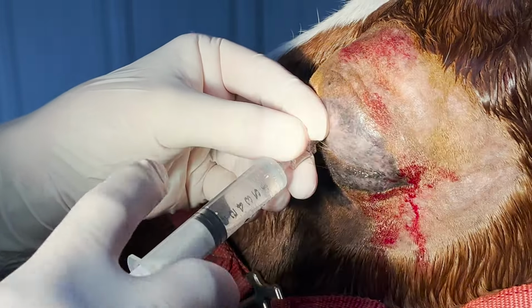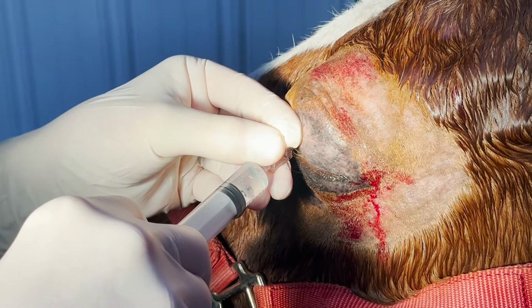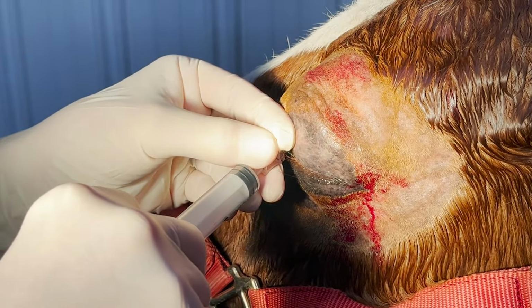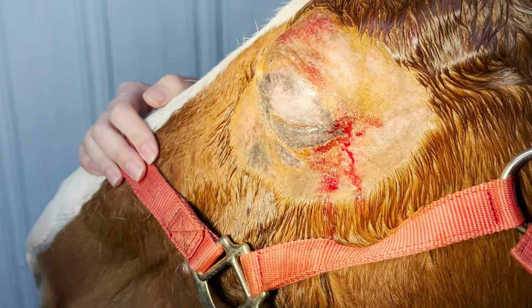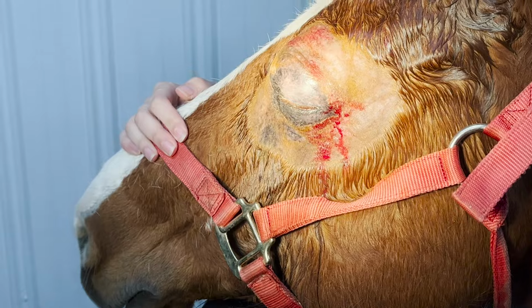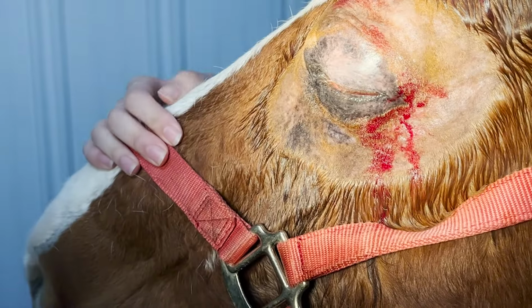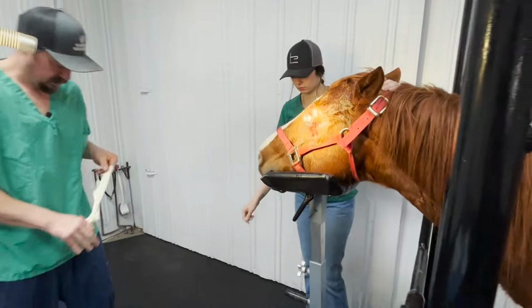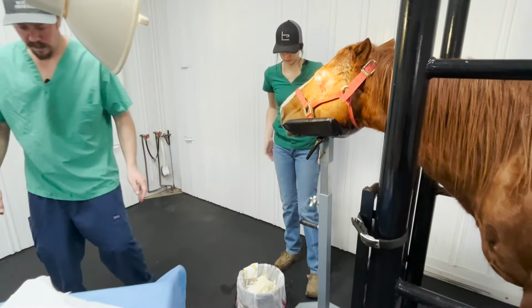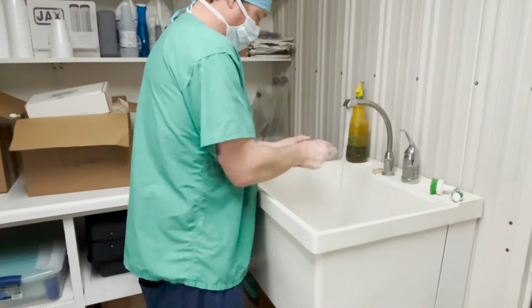Watch that fat pad up there, you'll see it kind of... Where I point to there, there's that fat pad I was talking about. You can see it kind of fill up with that stuff too. See how the eyes bulged out now? That's one right way you know you're in the right spot. And the local we put in there will diffuse out too as we're doing the stuff, everything to get back to that optic nerve. So that'll give our block a little bit of time to work.